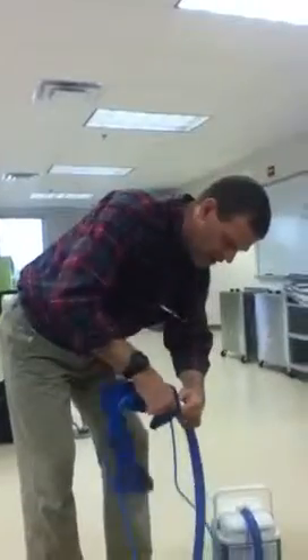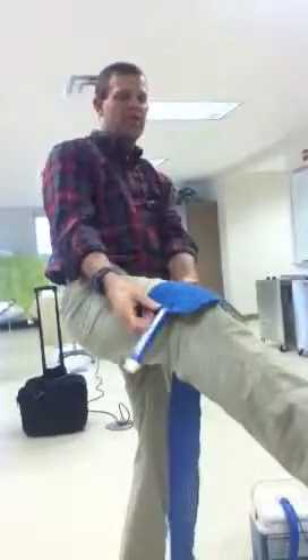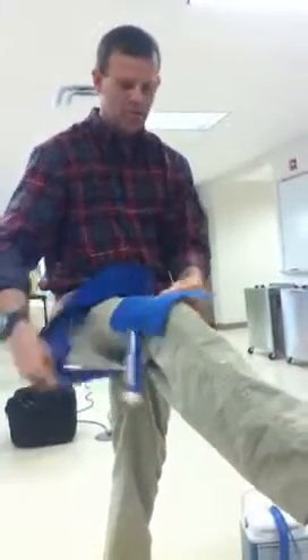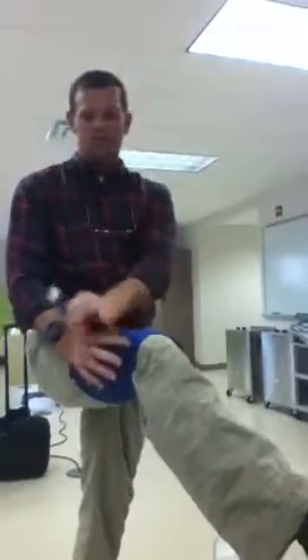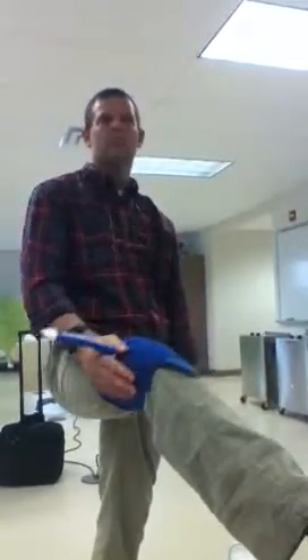A lot of times your patient will come out of surgery with this half on them already. They'll come out of surgery and they'll have this wrapped on their knee underneath — so there'll be a dressing and then a bandage, and then they'll be all ACE wrapped up and you'll just see this sticking out at the end of their wrap sometimes. Some of the surgeons will actually just put these on in surgery and then send them home with the polar care.